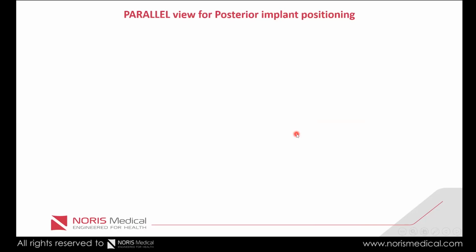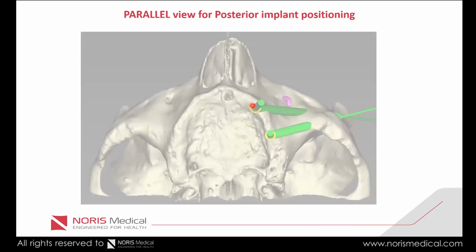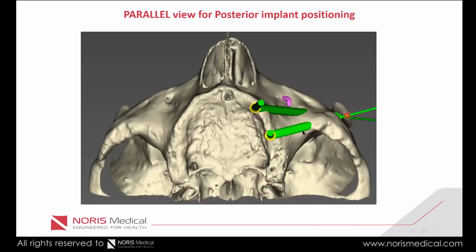Okay, let's talk about the parallel view for posterior implant positioning. When we place a posterior implant, in this case, the posterior implant is crossing the anterior implant.